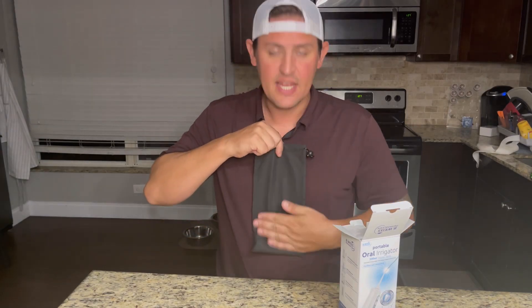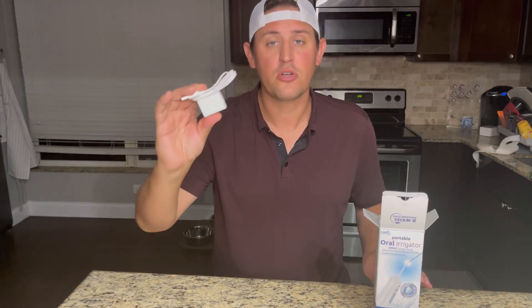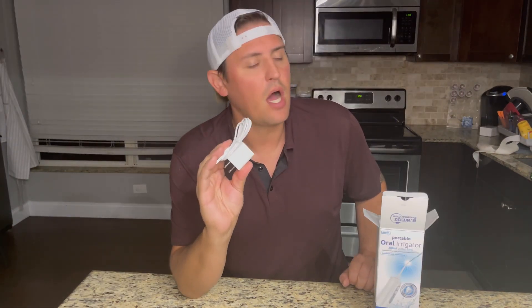You get the bag, and this thing just feels amazing. Next up, we got the little toothpicks — quick, get some food out of your mouth. The charging cord — this charge is unbelievable. I only have to charge mine maybe once every 30 days.